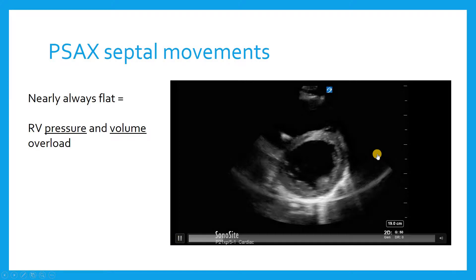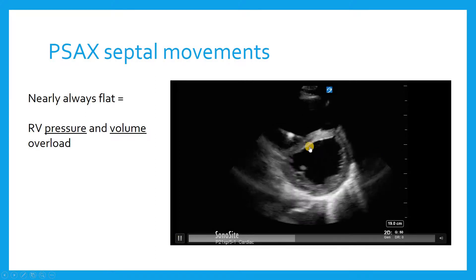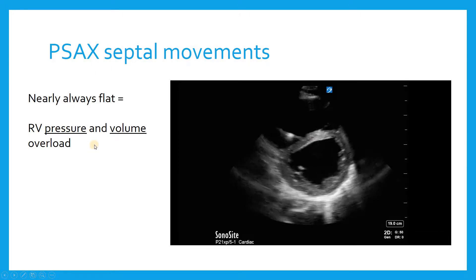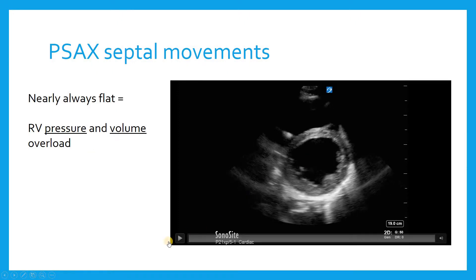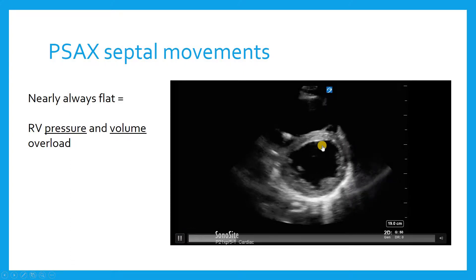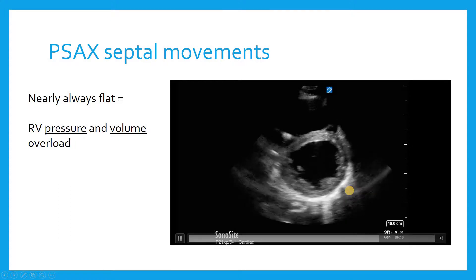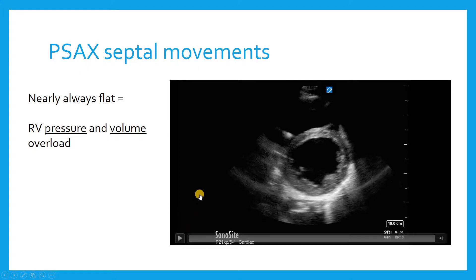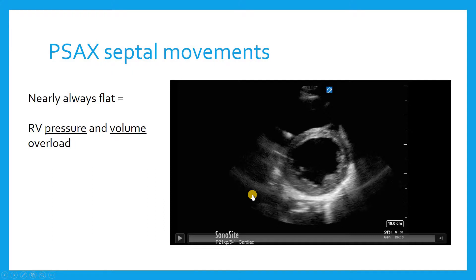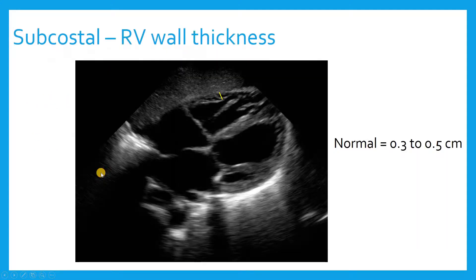When your left ventricle is almost always D-shaped and the septum is almost always flat, then you're talking about both pressure and volume overload. This patient's right ventricle and left ventricle really aren't moving very well at all. This image looks like there is a little bit more diastolic flattening than systolic flattening, but there appears to be a little bit of both — so that would be considered right ventricular pressure and volume overload. The inter-observer reliability of this assessment is anecdotally not very good, which is why measuring hemodynamics directly in the RV and PA is much more helpful than these qualitative assessments of septal flattening.